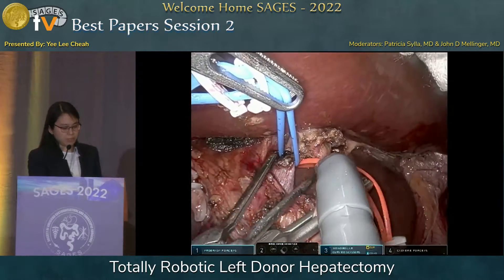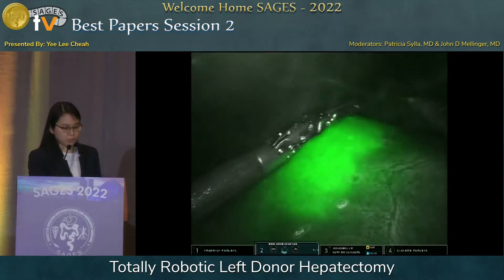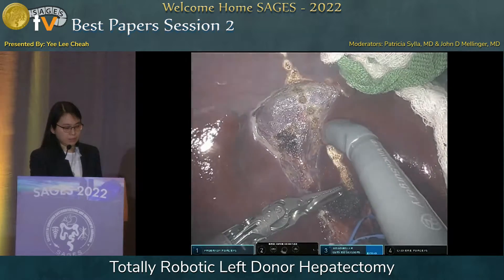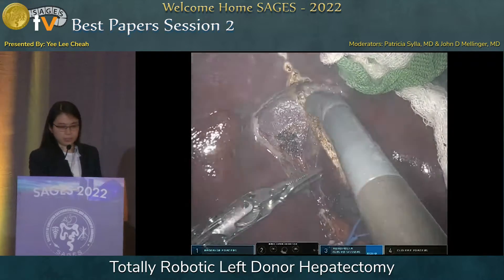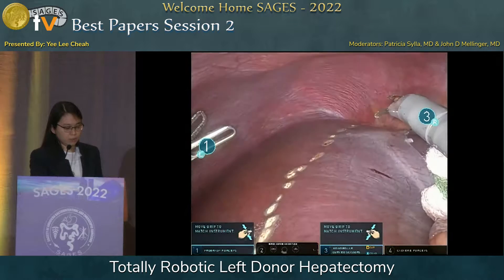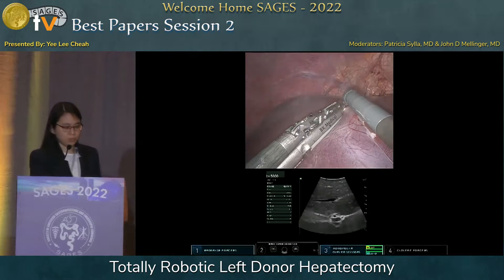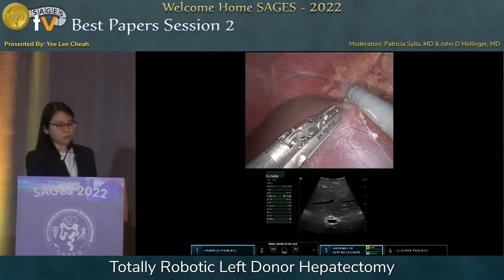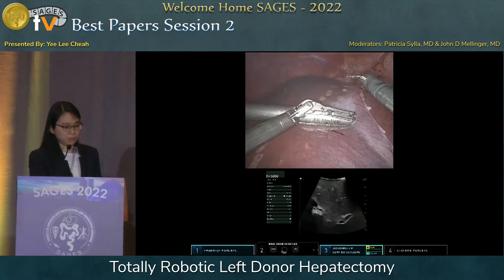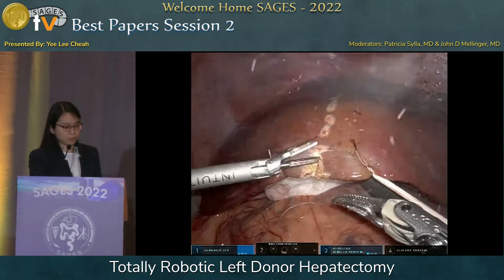The left hepatic artery and left portal vein are then controlled with vascular clamps, allowing us to demarcate the line of transection, which is enhanced by ICG technology. Once the clamps are removed, we perform an intraoperative ultrasound to mark the course of the middle hepatic vein, ensuring we are on the right side of the transection plane. The segment five branch locations are also marked.